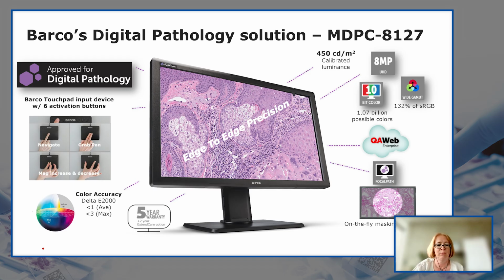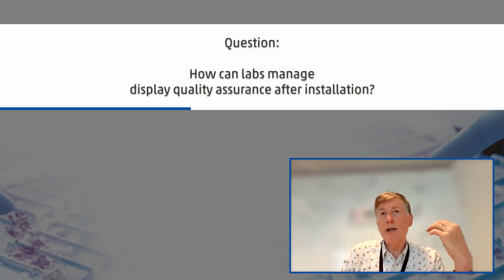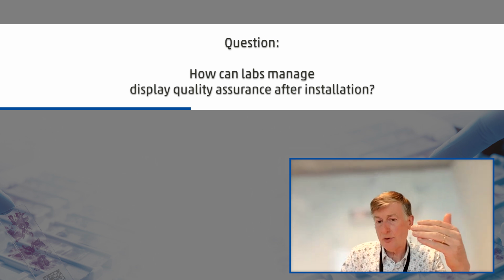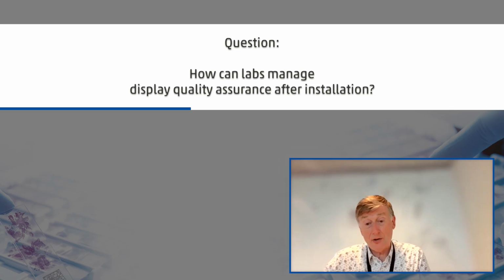Okay, so let's come to the questions of the audience. On a medical grade display, most of the vendors provide internal sensors which can do automatic measurements. This is typical. You can only measure the white with a backlight sensor on the back. But if you want to measure colors, you need a front sensor. And most of these medical grade displays have a front sensor. So that means if you have some software, you can schedule it to say overnight, I want this display to warm up, do its measurements, and then send them over. It stores it locally or sends it to a central server.